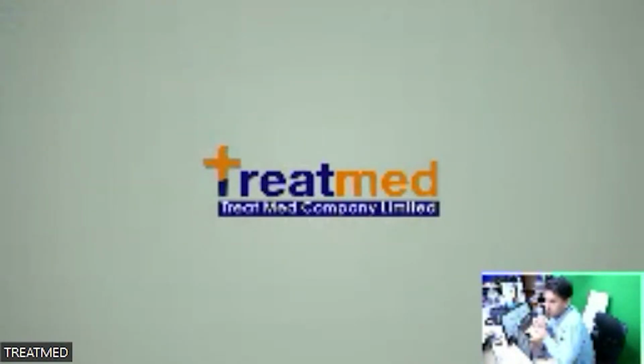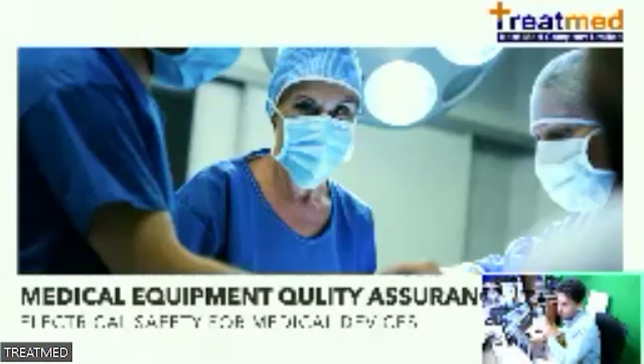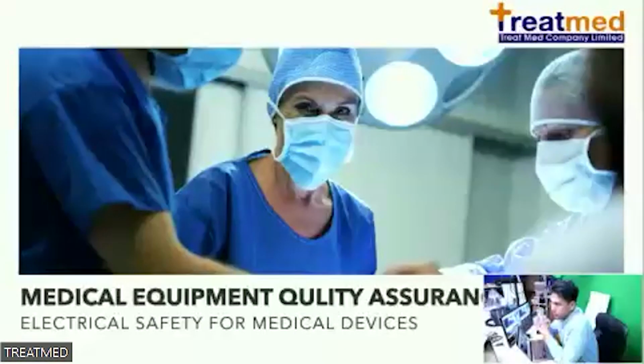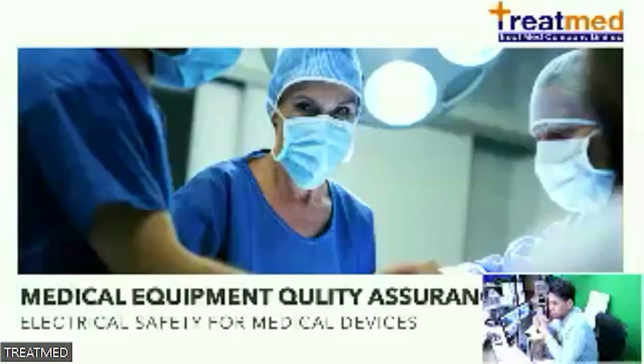Okay, let's come to the electrical safety theory. All the medical devices in the hospital use electricity, right? So it's necessary to do electrical safety testing first and then use it, because the medical device in the hospital must be safe.